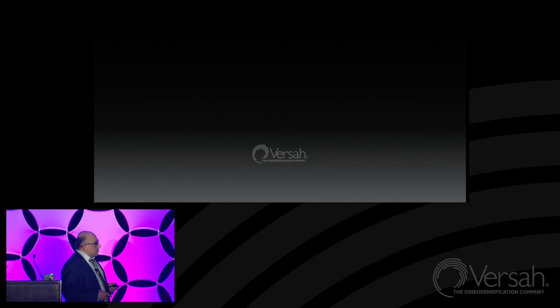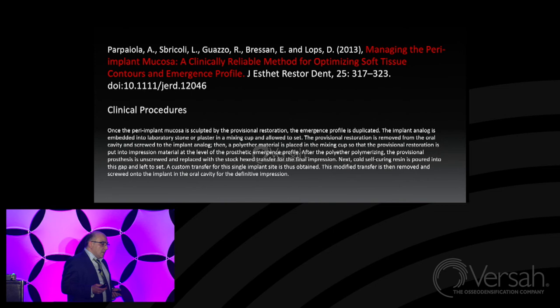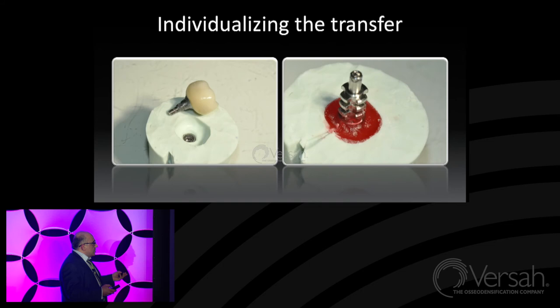Look at this. This is the technique. Here it describes how we got it, the usual technique. We got our implant analog, attach our temporary crown to this analog, then make dies with the silicone, take out the crowns, and fix our transfer, which we use for open tray technique. Fill this place with flowable composite or pattern resin, never mind, here it is. This is the temporary crown, we take it out, attach our transfer and fill the gap between the transfer and the contour of this die with anything, with flowable composite, with pattern resin or anything else.